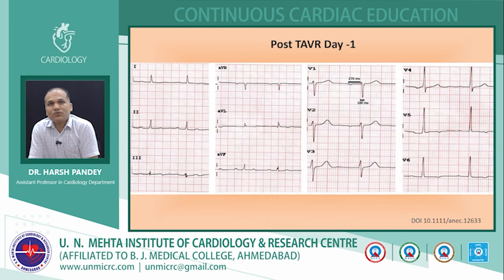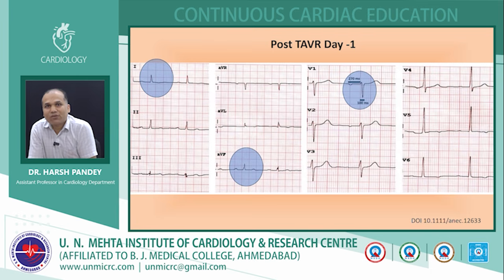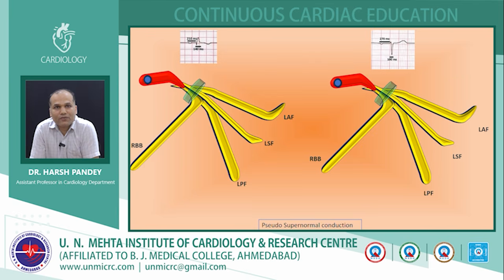On post-TAVR day 1, after the patient underwent TAVR implantation, you can see the PR interval has become 270 now, and the QRS has become normalized. You can see the axis has also become normal. So what has happened here? Now we will understand.